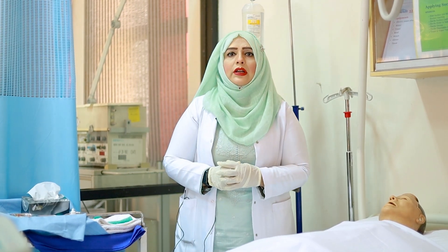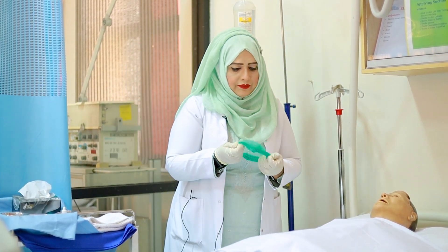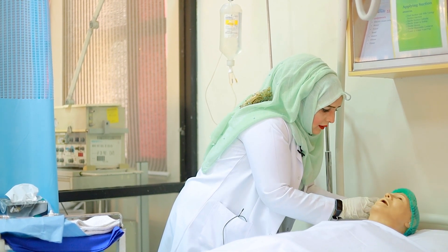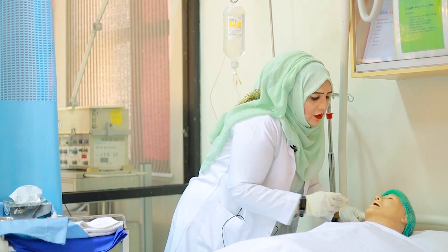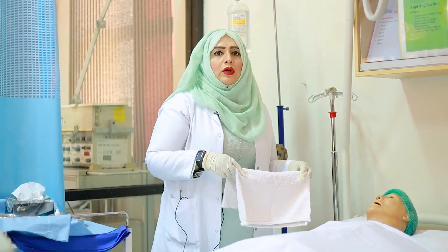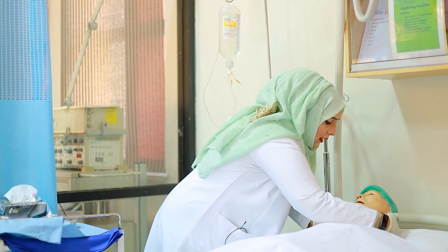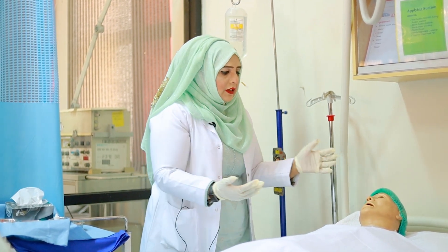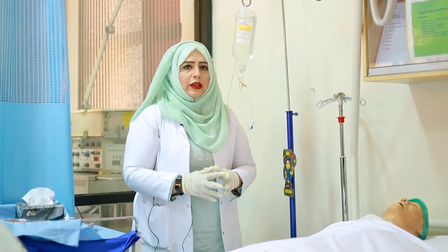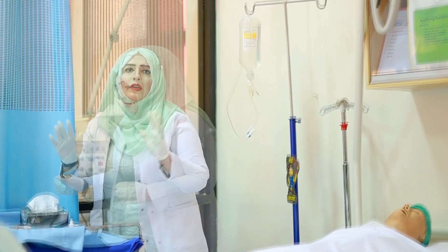Before starting, I will redo my hand sterilization, then apply the cap to the patient. The purpose of applying the cap is so the patient will not get wet. At the site where you are going to do the irrigation, you must put your towel under the head of the patient on one side. Always remember, for any eye procedure, you must tilt the patient's head a bit. So now the position of my patient for eye irrigation is ready. At this point I have to again do hand hygiene and change my gloves.